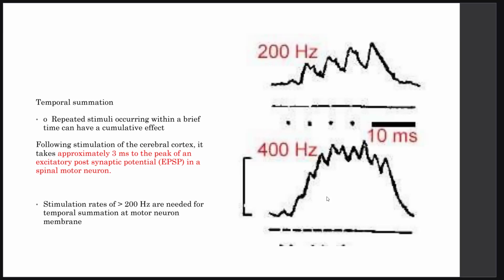But don't forget that you should not stimulate at a very high frequency, too quick, because if you stimulate too quick, your stimulation will go into the refractory period of the action potential and it will fail, be zero. And you should not go too slow, because when you go too slow, the response will be delayed at the synapses, so you cannot get benefit from this temporal summation. The responses will be degraded and fade, cannot be added. That was the stimulation.